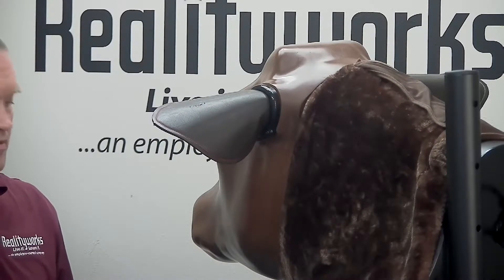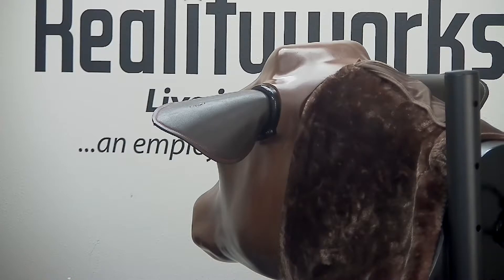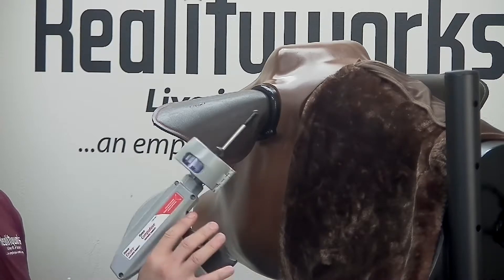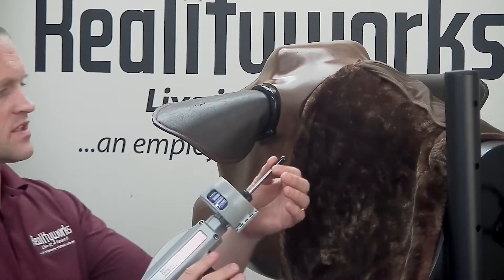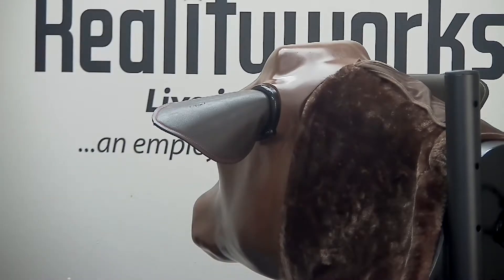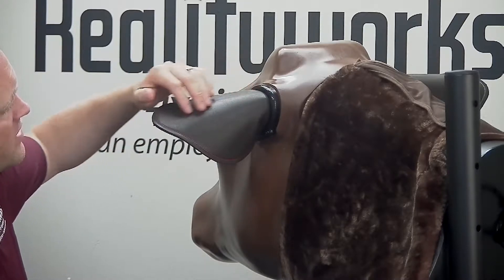To insert a growth implant, you'll need a bovine injection simulator and a growth implant gun, which is not provided by Reality Works. Remove the protective covering. You will inject on the back side of the ear.